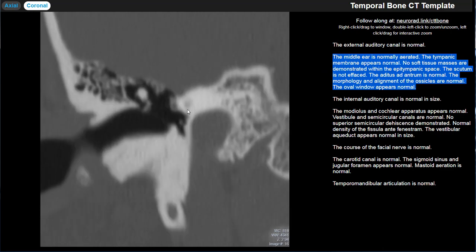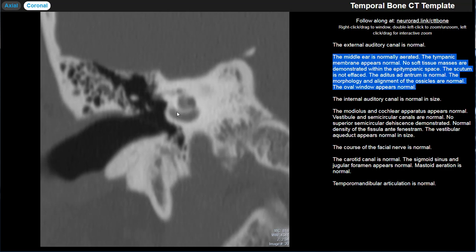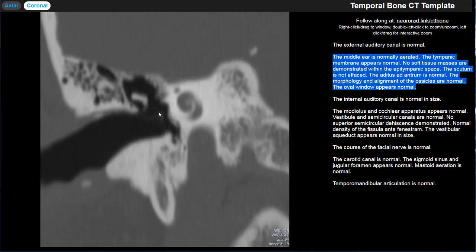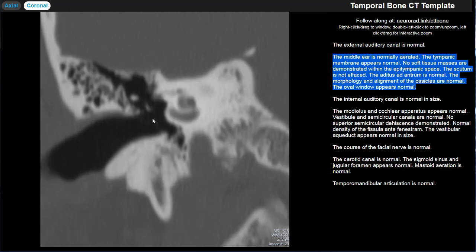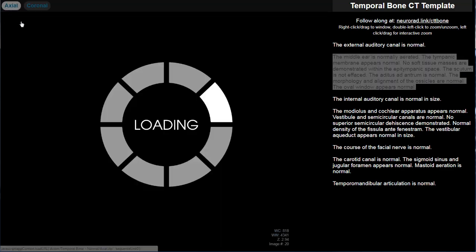Moving on to the middle ear. The middle ear is roughly divided into three areas: an epitympanum, a mesotympanum, and a hypotympanum. The landmark for the epitympanum is a line from the scutum to the facial nerve tympanic segment underneath the lateral semicircular canal — everything above is the epitympanum. A line from the tympanic annulus to the cochlear promontory marks the hypotympanum below, leaving everything behind the tympanic membrane as the mesotympanum.